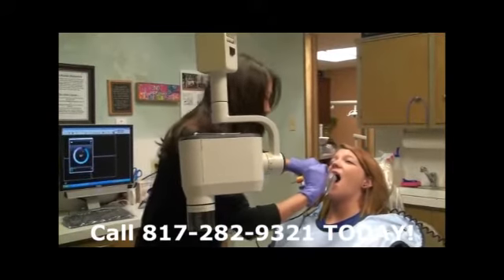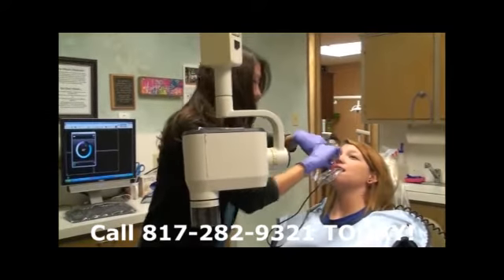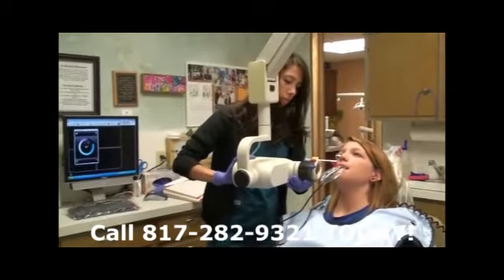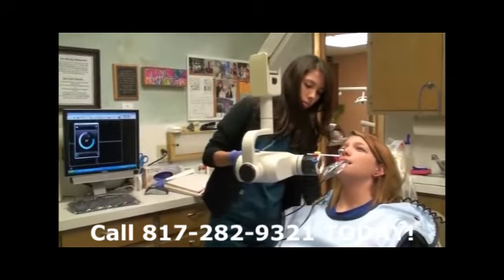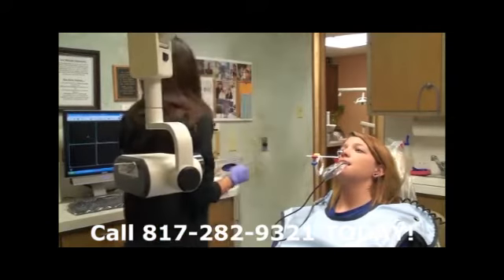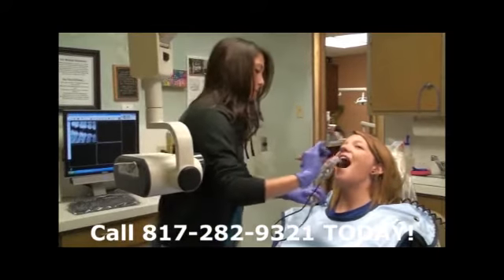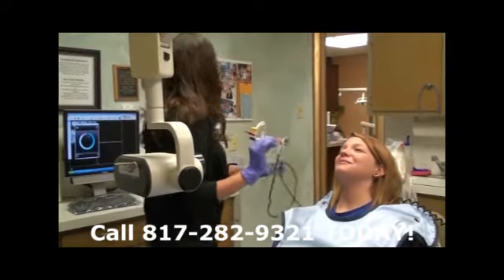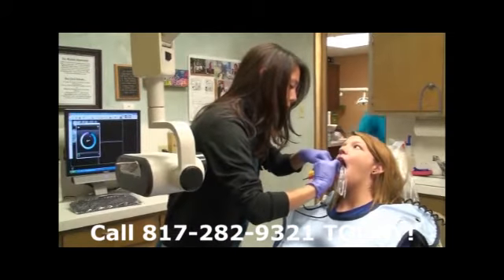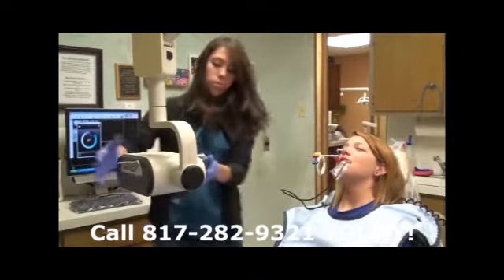Go ahead and open. And bite together. There we go. Okay, go ahead and open again. Okay. Go ahead and bite together. There you go.